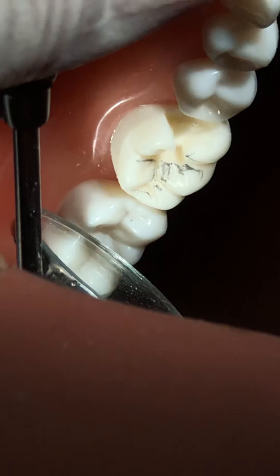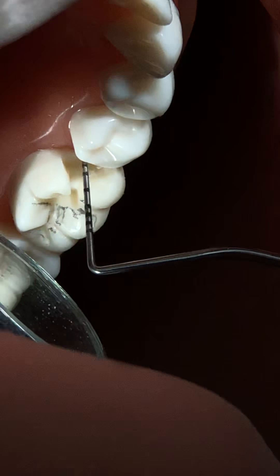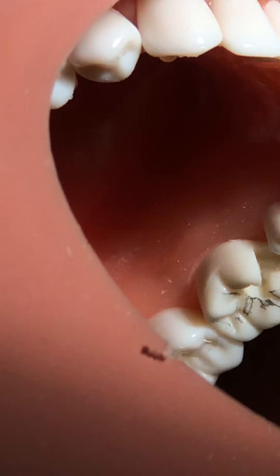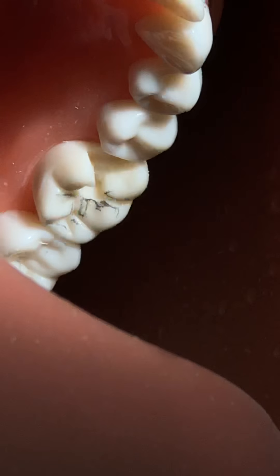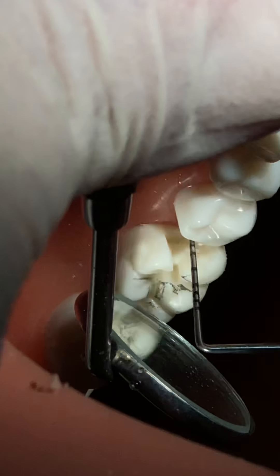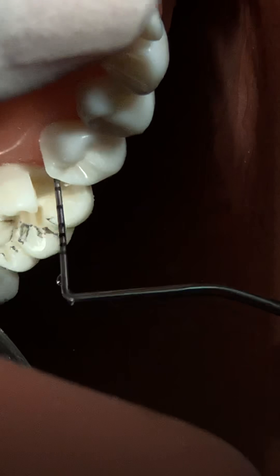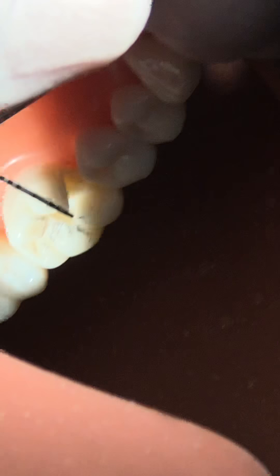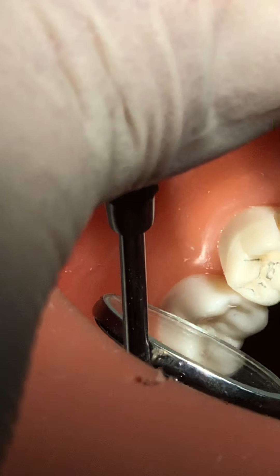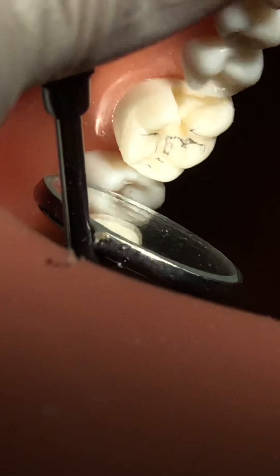The other important thing is clearance - the gingival floor should be clear at least 1 millimeter from the adjacent tooth. You need to be deep enough because as you go from occlusal towards the root, the tooth narrows. So as you go deeper you are creating clearance. You can verify by placing a probe tip inside to confirm clearance. The cavosurface angles should be smooth, and the gingival floor is slightly convergent. This is how your cavity should look - the final shape.